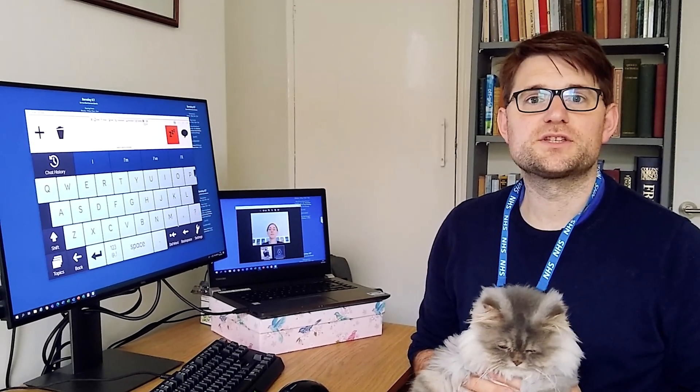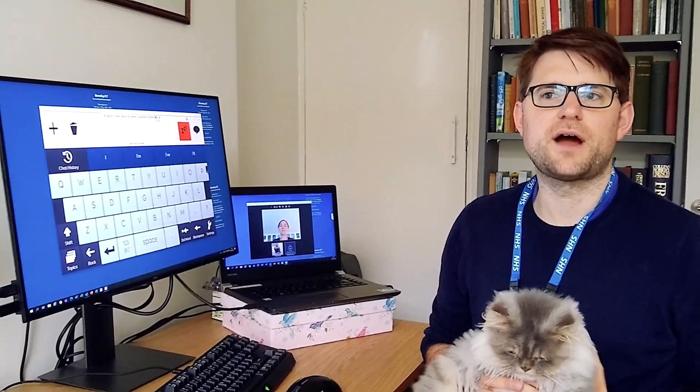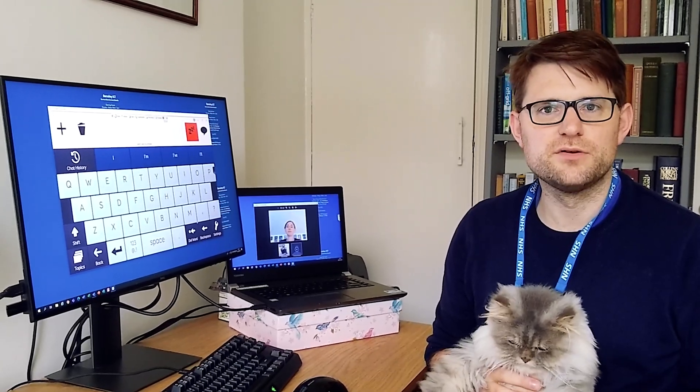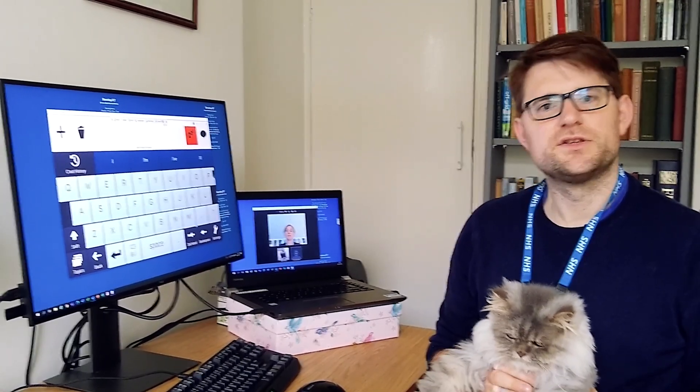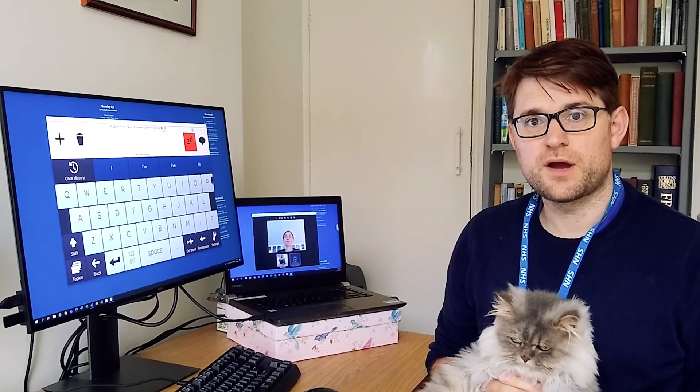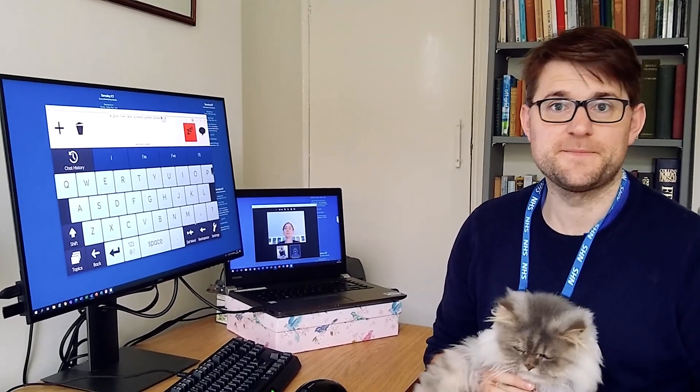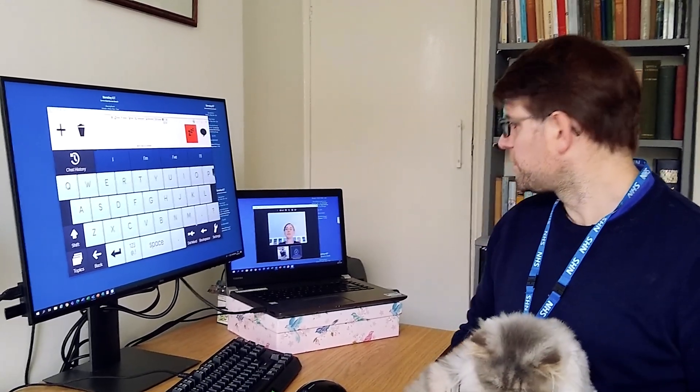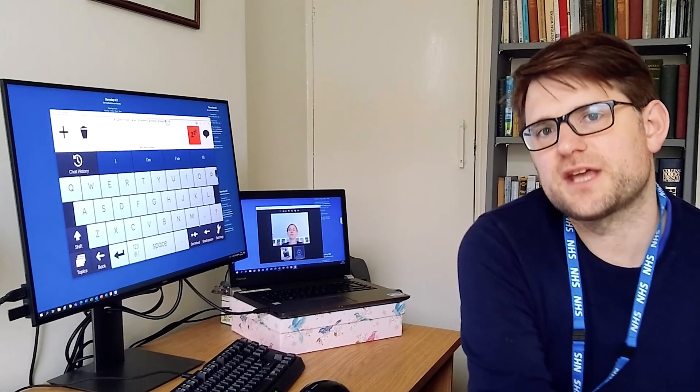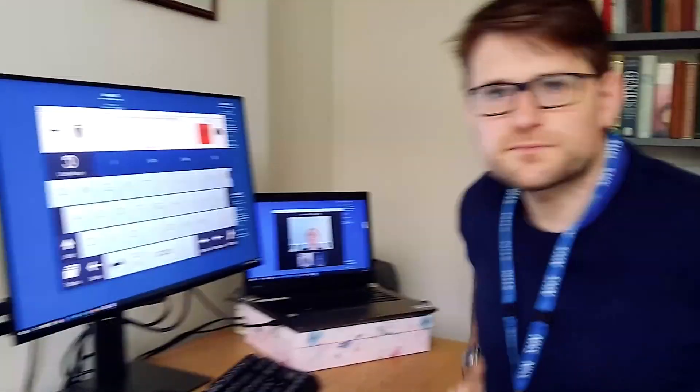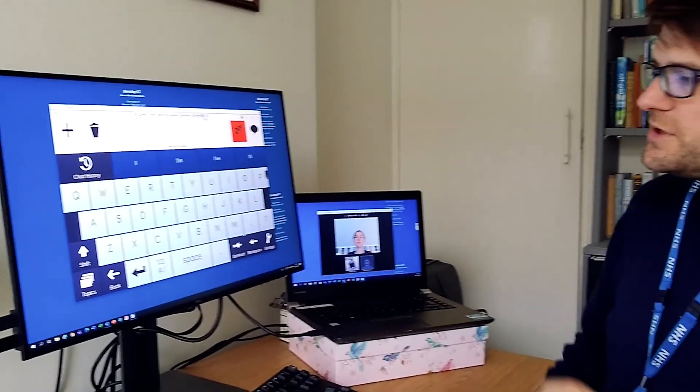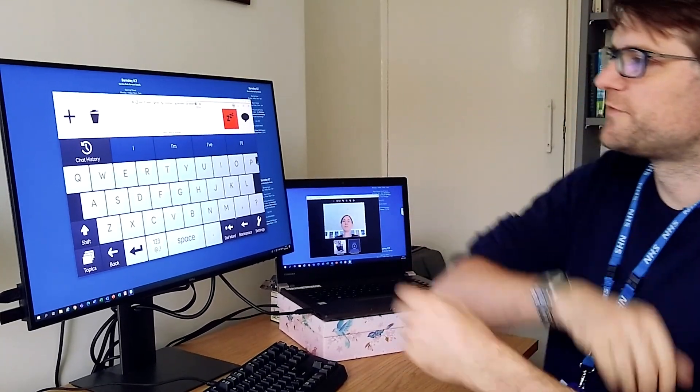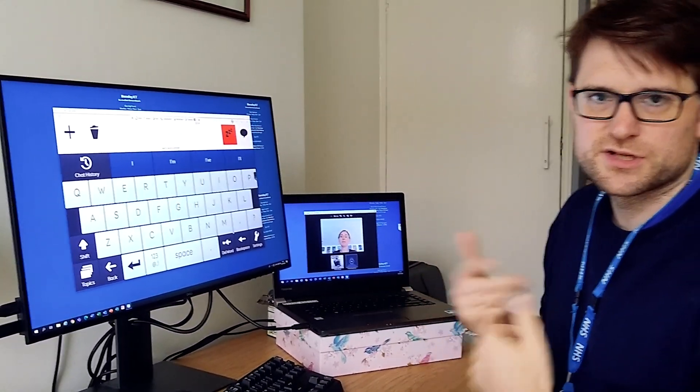There's been quite a lot of chat online about how people are doing remote eye gaze assessments, so I thought I would show you how I'm doing it. What I've set up here is TeamViewer, which is a way to connect to other people's computers.